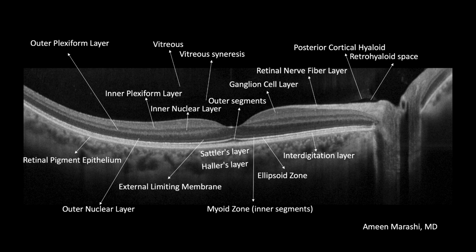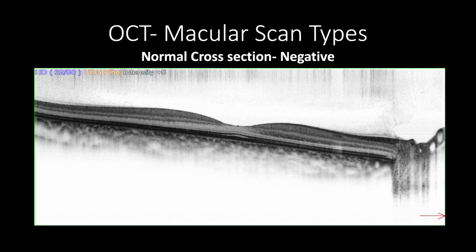layers; sometimes the suprachoroidal space and sclera can be visible, especially when using swept source OCT. Black and white negative OCT images may be applied clinically to study hyperreflective tissues, which are marked in shades of black color, to study vitreous changes and their relation to the inner retinal tissue, and can be a great tool to evaluate RPE and outer retinal layer changes.